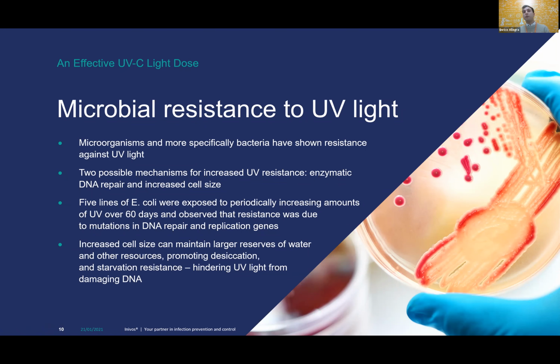If you only take your antibiotics for 3 days rather than 5 days as prescribed, although you feel better and feel like your infection is gone, all you're doing is leaving behind some bacteria which have been exposed to the antibiotics and will eventually start to develop resistance. And again, that's the same concept with UV light. We don't want to leave too much behind. We want to come in with the correct dose and be able to eradicate everything to avoid a surge in resistance.